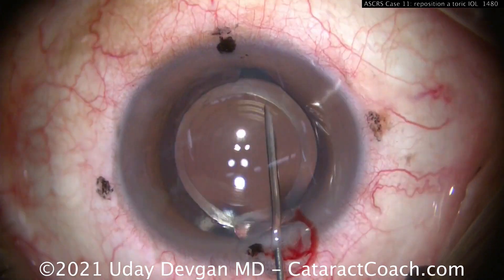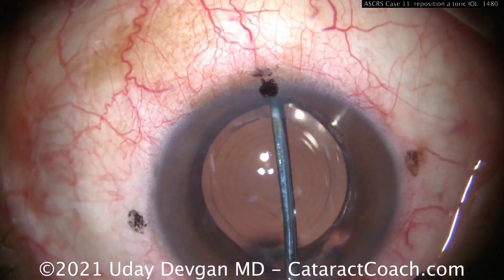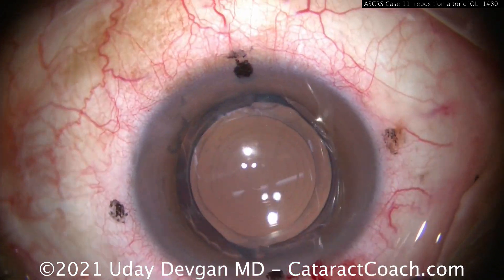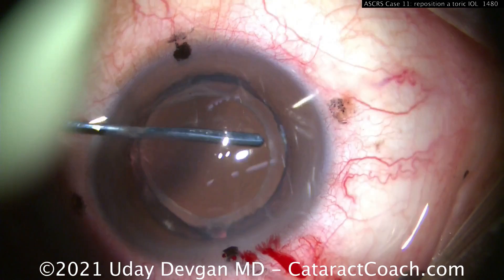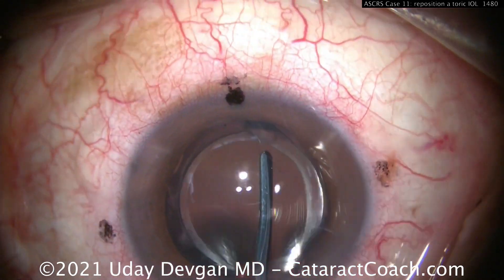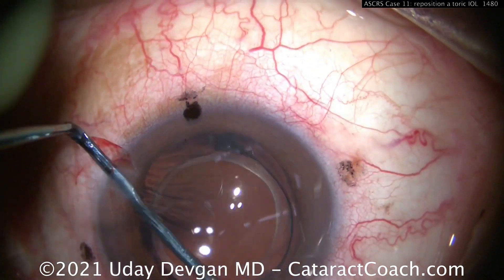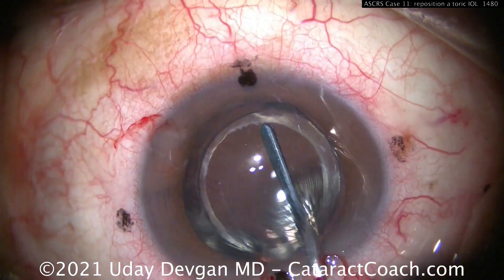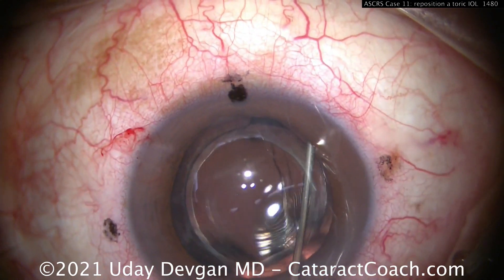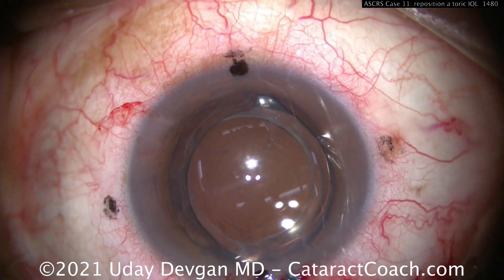Now we'll get under there — you know the technique: 27-gauge needle, bevel down, to get a little viscoelastic under the edge of the rhexis. Use the spatula to help spread that open and go around nice and easy in all directions. But remember, the issue here is that the haptic can be stuck at the capsular bag equator, especially with this lens that has a bulbous tip.